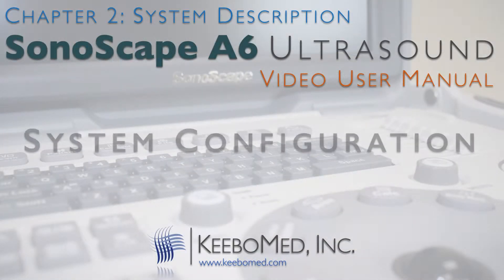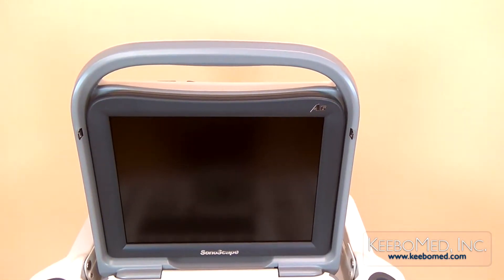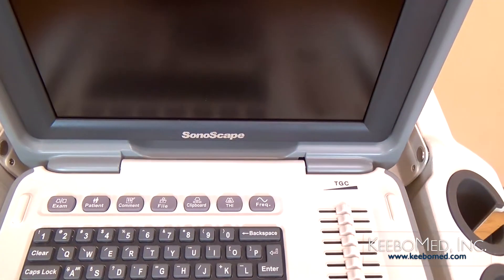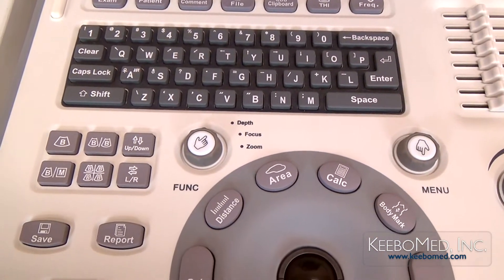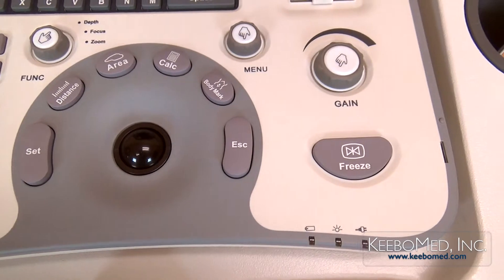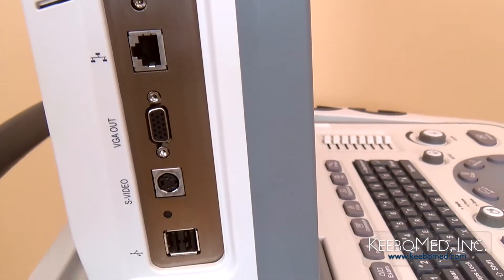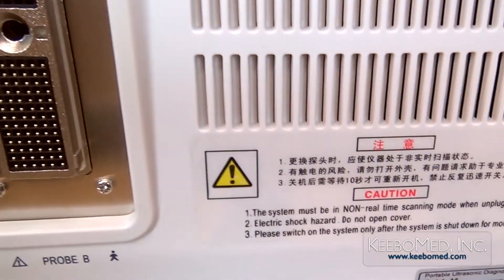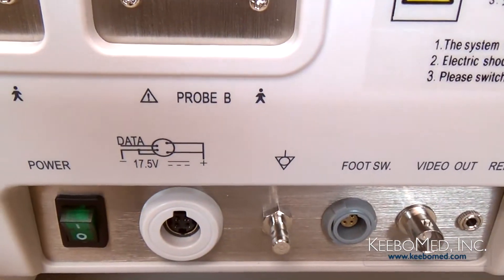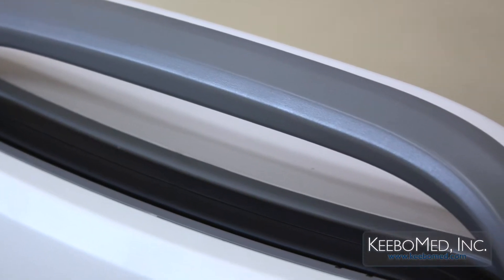Here is an overall look at the design of the A6. The top of the ultrasound has a strong integrated carrying handle.